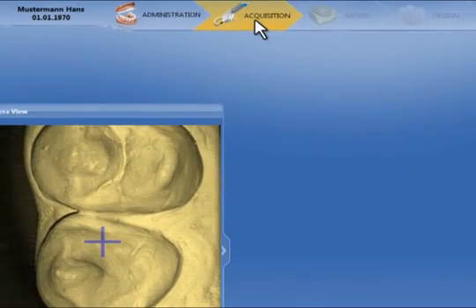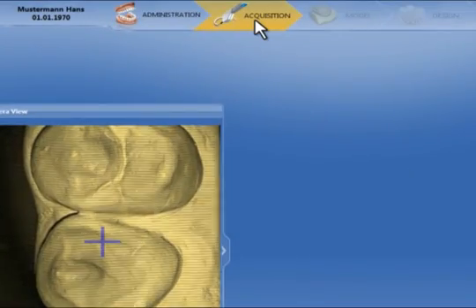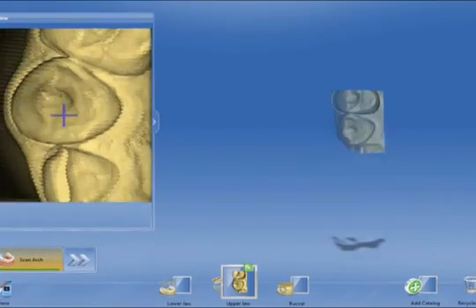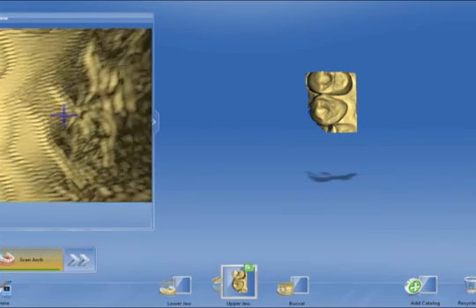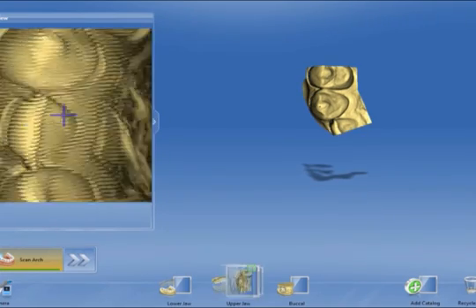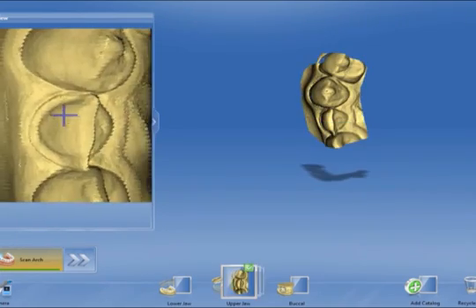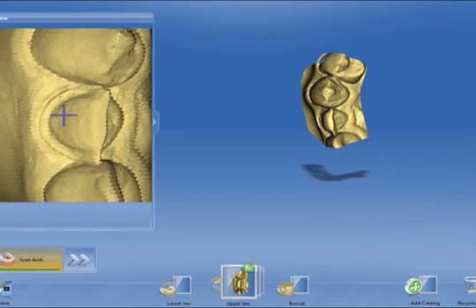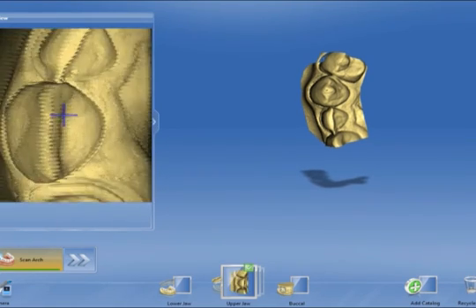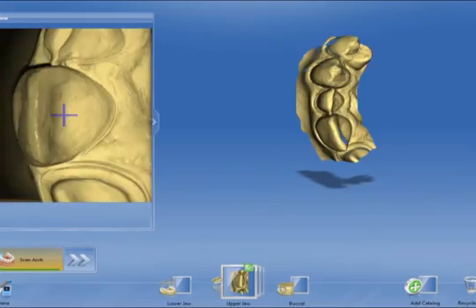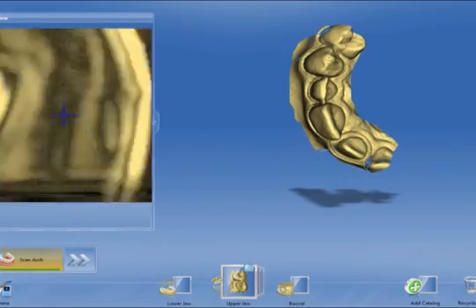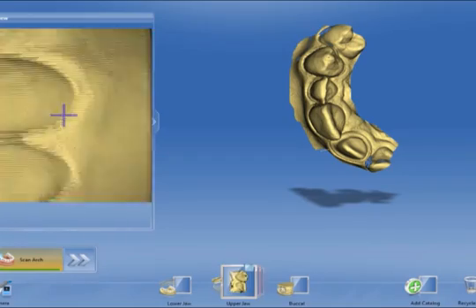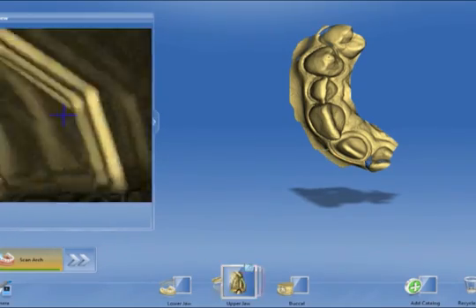In the acquisition phase, we now scan our preparations intra-orally: on tooth 2-2 a veneer and on tooth 1-1 a full crown. We commence at the premolar with overlapping scans towards the front. With the veneer, we pay particular attention to also capture sufficient facial surface and scan until the opposite side in the premolar area.